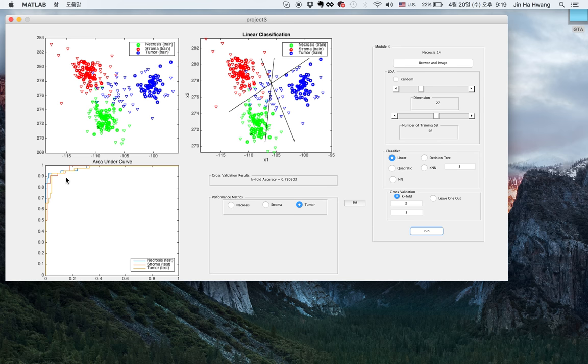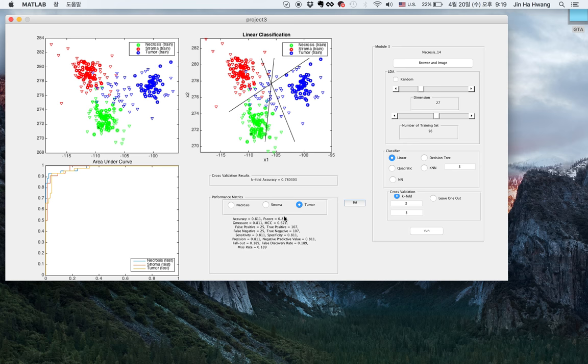This is the area under the curve, and we have an accuracy of 78%. If you press this, it will give you the performance matrix results for tumor, stroma, and necrosis.